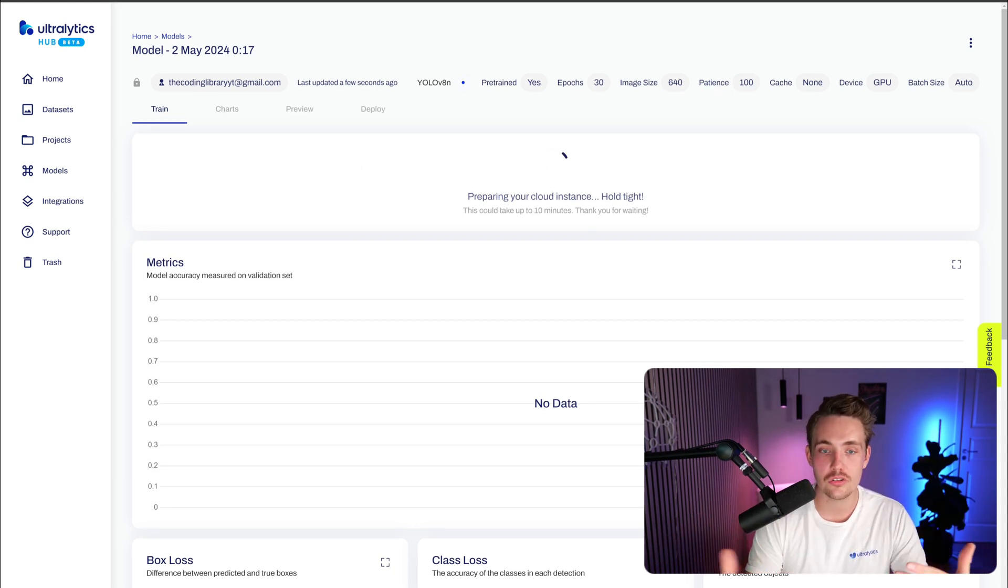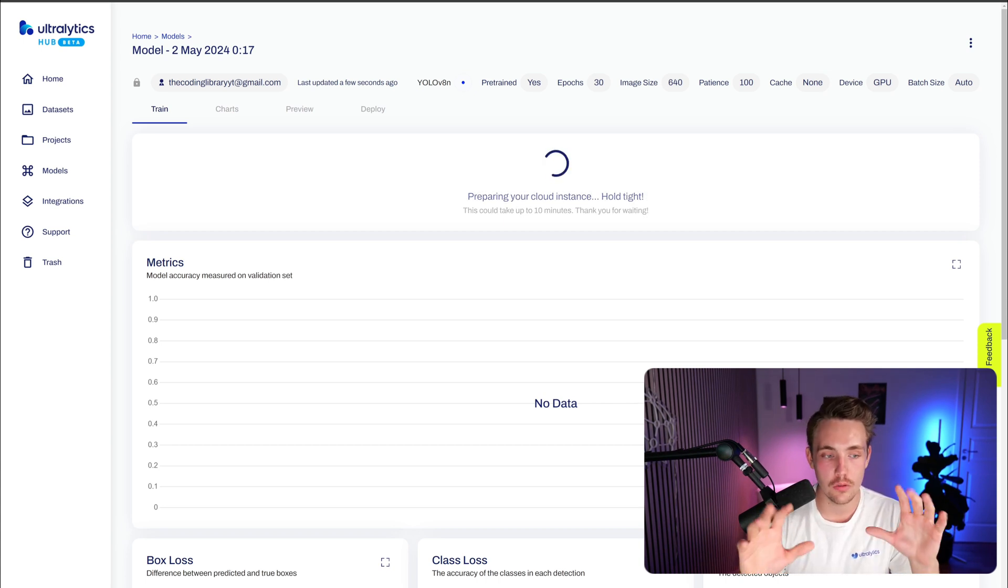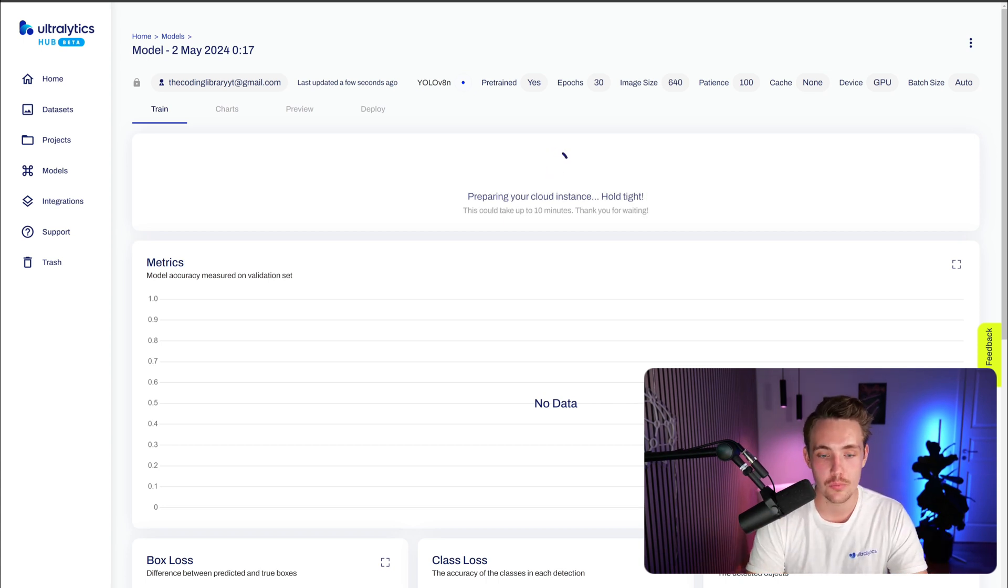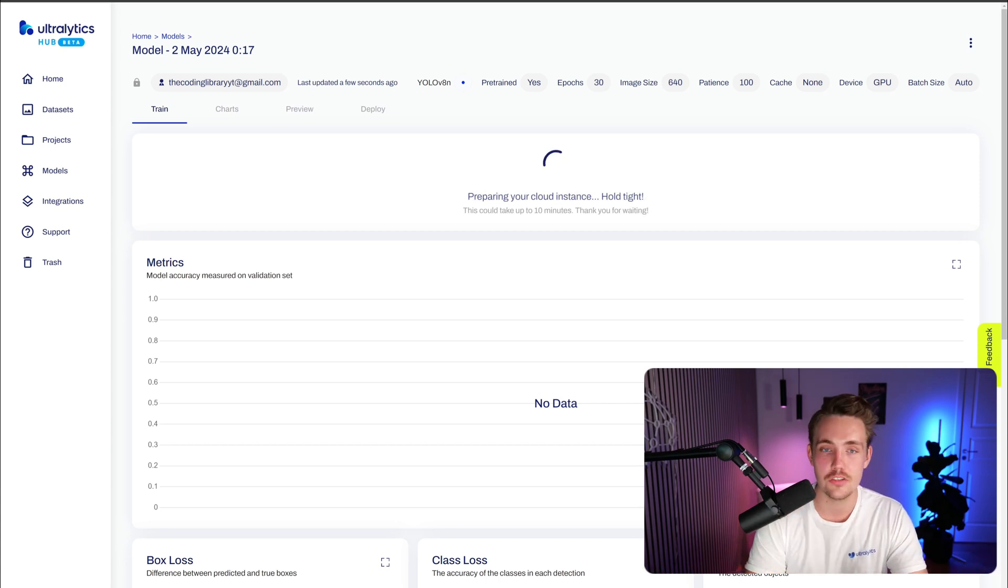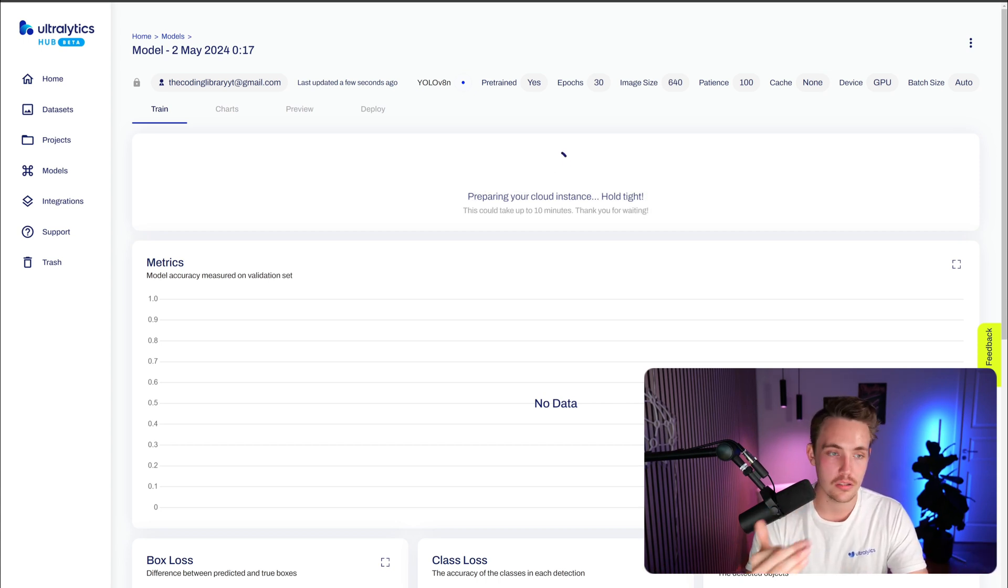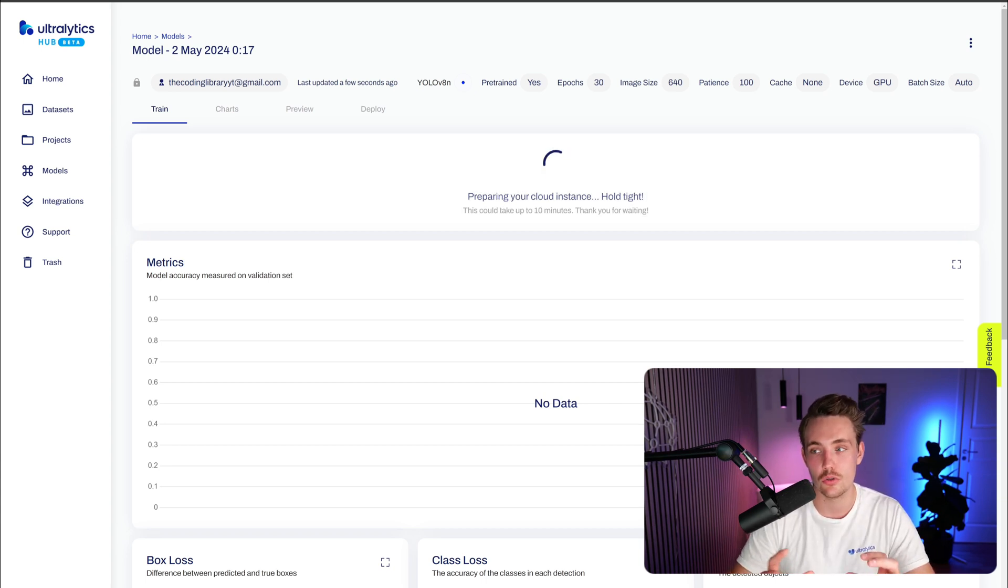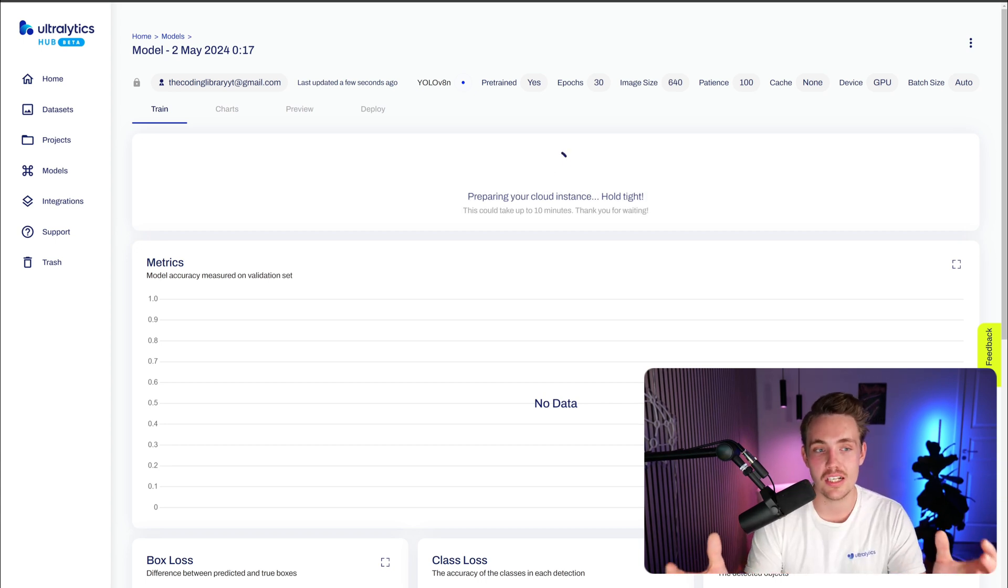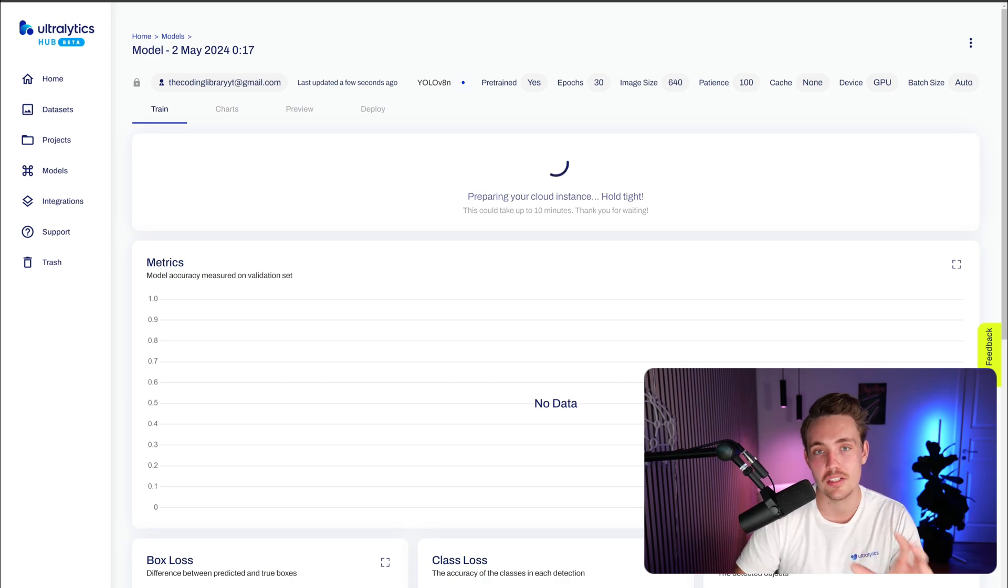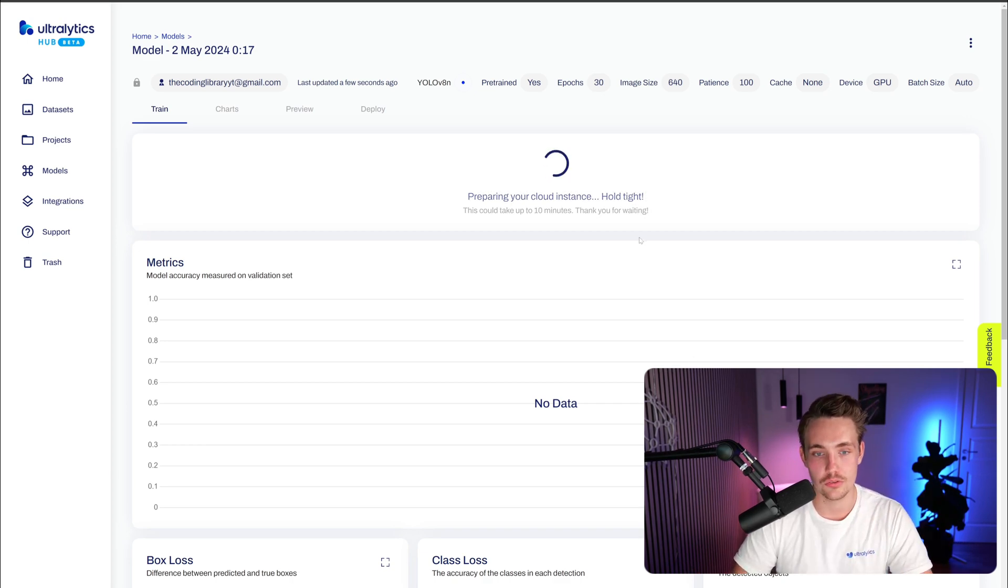It's just going to prepare the cloud instance. Might just take a few minutes. After that, it's going to start the training. It will log the metrics directly in here, live. In some of the videos, we go over each individual step, what all the metrics mean, the chart preview, how to deploy the models and so on. We test out on a bunch of different data sets, but every single feature inside Ultralytics is covered in other videos.